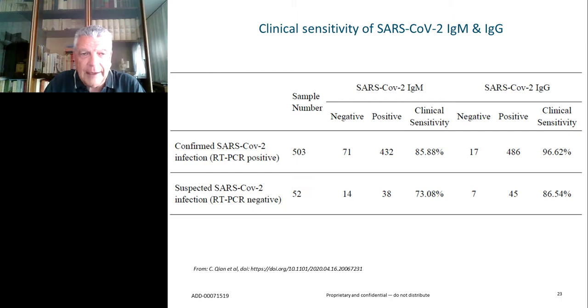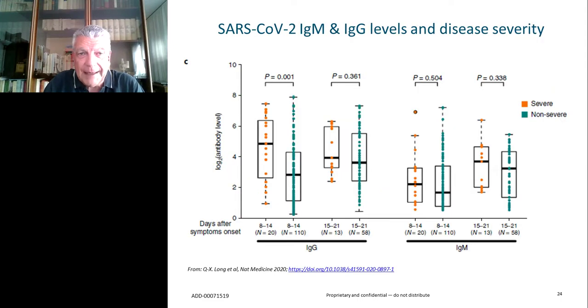Another evidence still on a quite huge cohort brings up the same kind of results. You see here that the positive rates for IgM and IgG showed some 10% difference cumulatively. And this happened in both RT-PCR positive and negative infections, so different phases of the disease or infection. So overall, it looks like a good assay for IgG will yield a very good sensitivity regardless of the detection of IgM. But IgM may still be relevant if you're able to discriminate the two responses, as you will see soon.